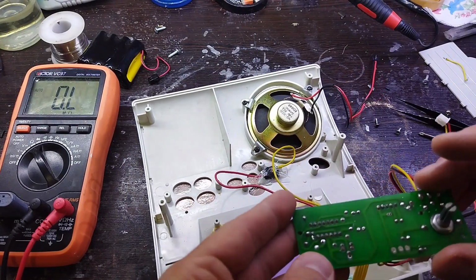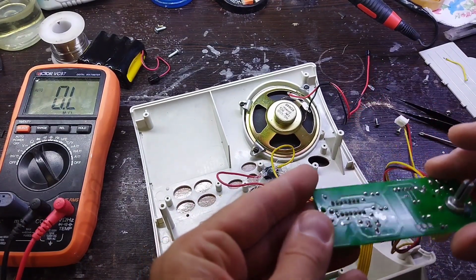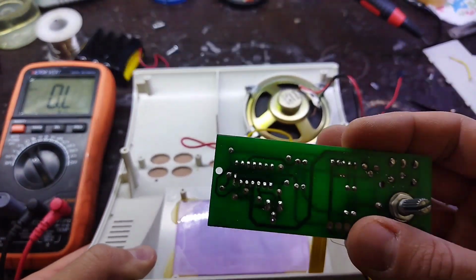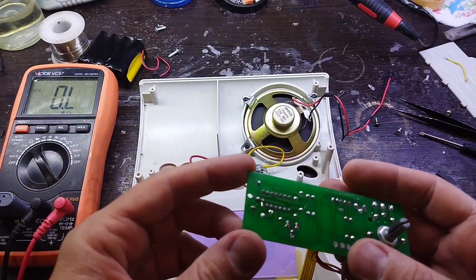The probe is one of the main parts of the device. This device sends ultrasound waves into the uterus. It also receives the wave reflection.